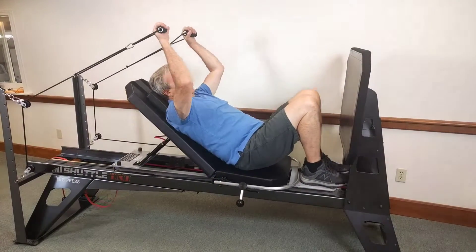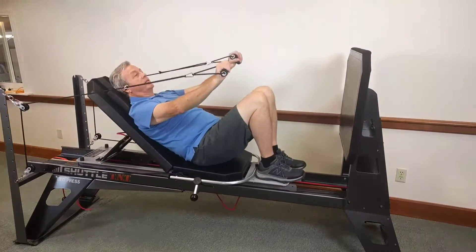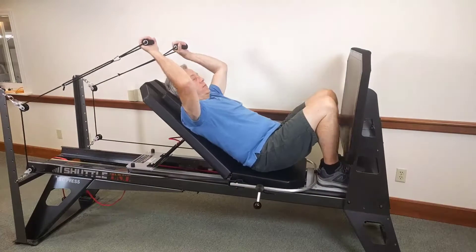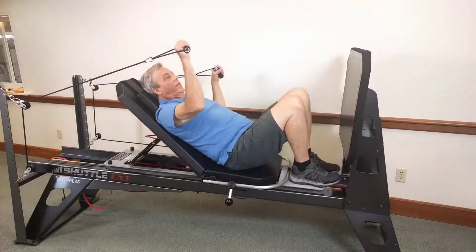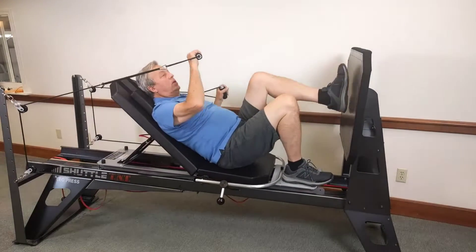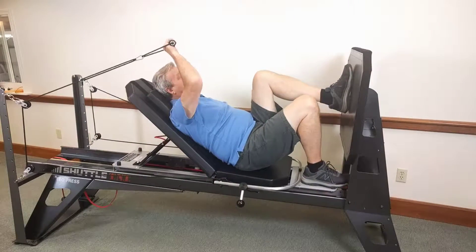Now I'm going to show you using with the headrest up, so for your older patients they can be in the comfortable heads-up position and still use the pin and pulleys here. So we can do a cross pull like this, or we can add the foot as well.